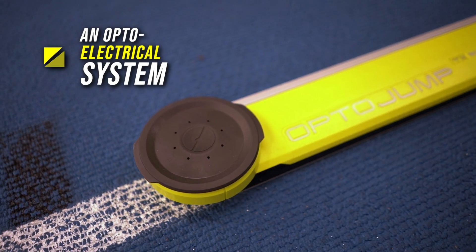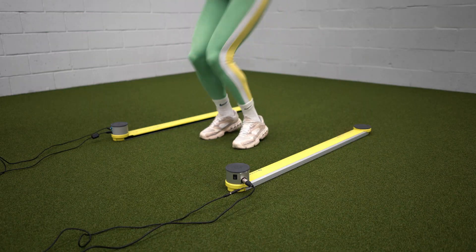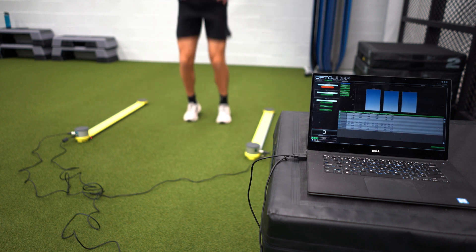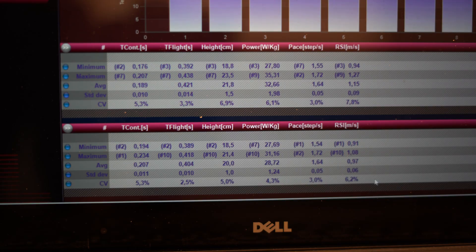The OptoJump is an optoelectrical system, which means the bars communicate with each other via a laser signal that gets sent from one side to the other. The duration and place of every interruption gets detected, and from there a lot of calculations can be made to determine a lot of interesting parameters.